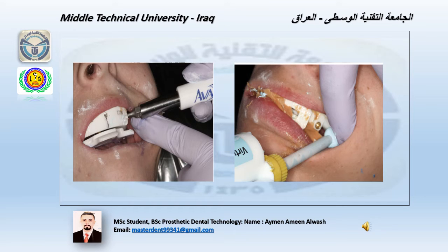Now we are ready to inject the material between the upper and lower tray to seal and save the relationship between the maxillary and mandibular tray.